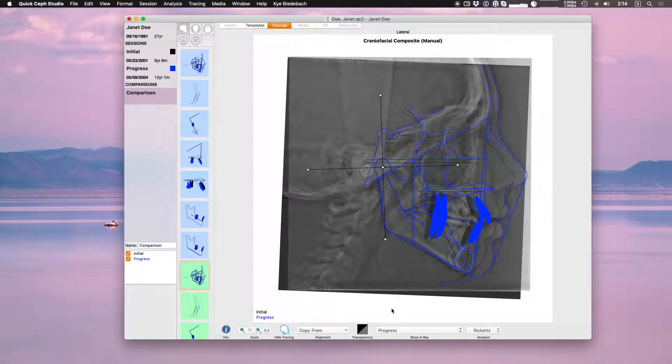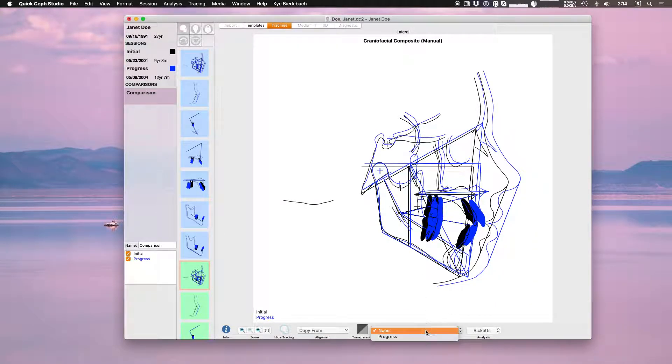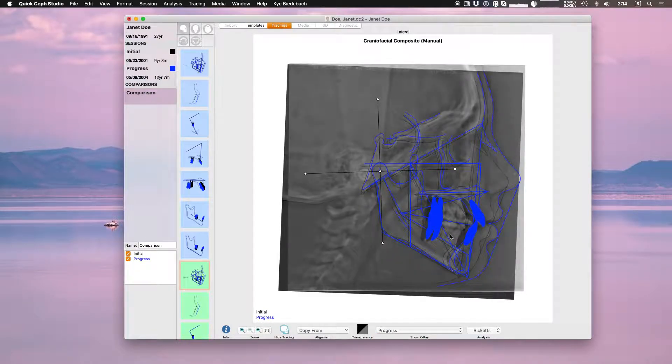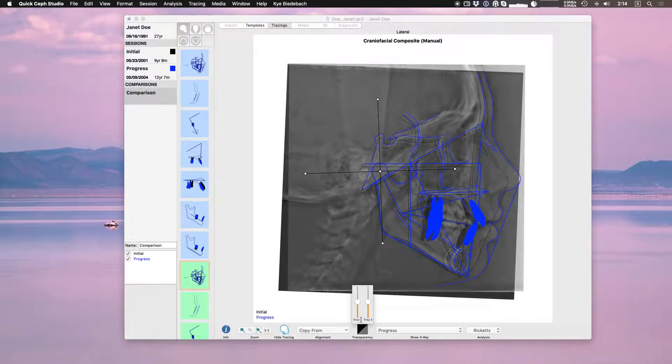When I'm done I go back to none and it will stick with that superimposition I left it. If you go back to showing an x-ray you can also adjust the transparencies.